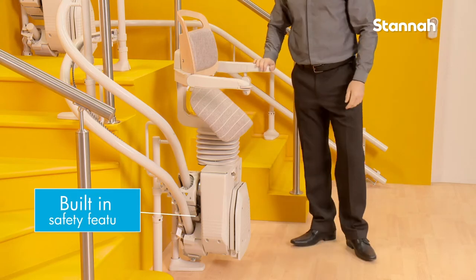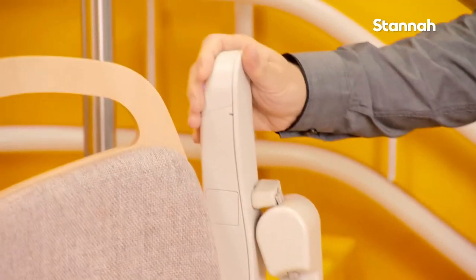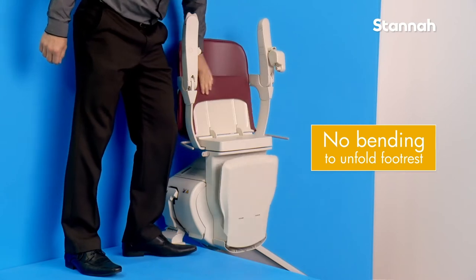One of the built-in safety features of the Stairlift is that the footrest will always fold when you lift either the armrests or seat. So there is no need to bend down to fold your chair away at the top of the stairs.